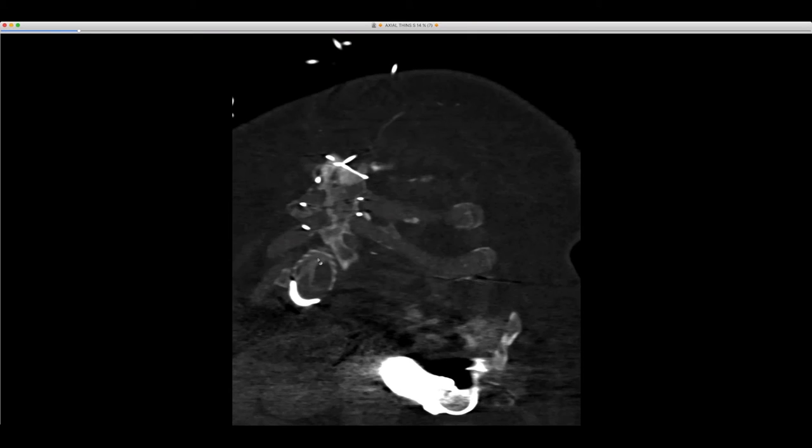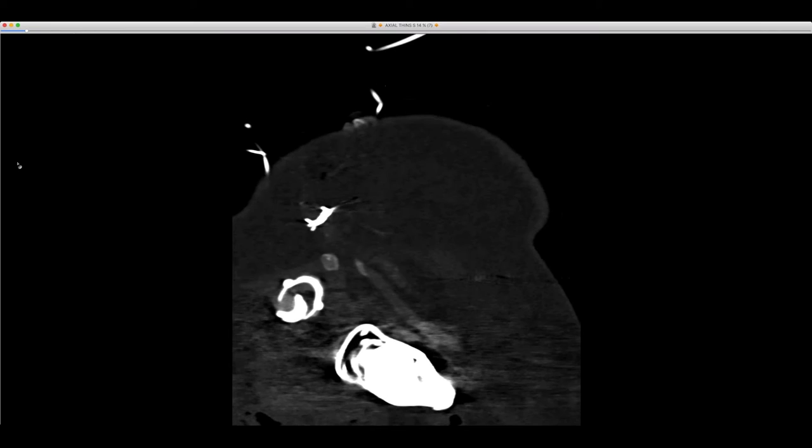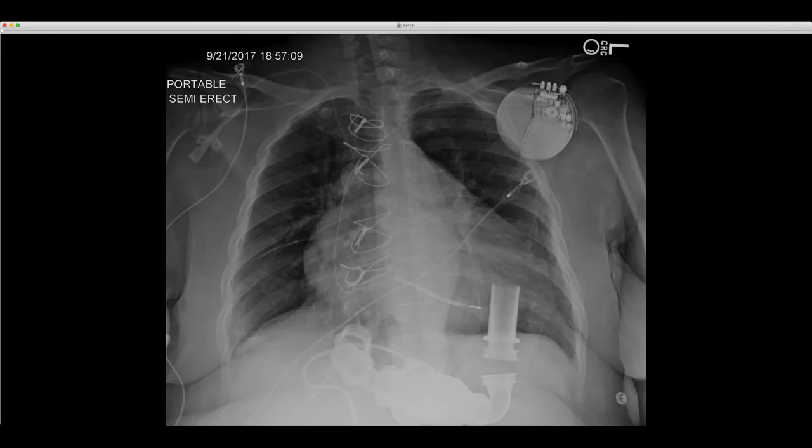These were recalled, I think in 2013, because of this known problem with the modular component of the bend relief. This patient had their procedure done before that. Anyway, I just thought that was a good case of LVAD thrombus that's largely within the wrap and due to dislodged bend relief. But going back to the radiograph here, you can see the dislodged bend relief right there. It should be continuous like that. It's dislodged.